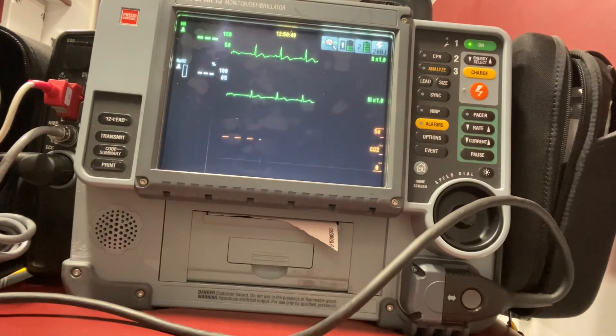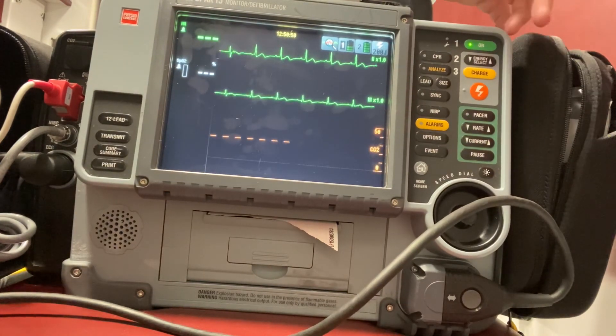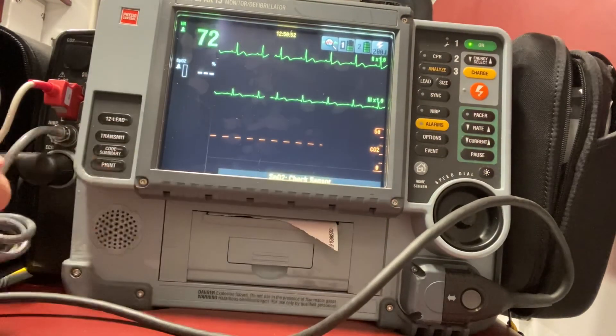This time it worked for my patient. They went into a perfect normal sinus rhythm.